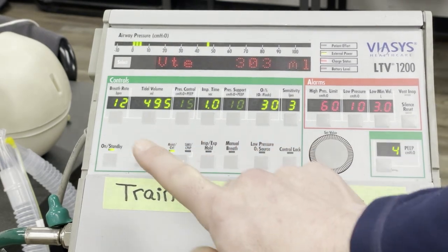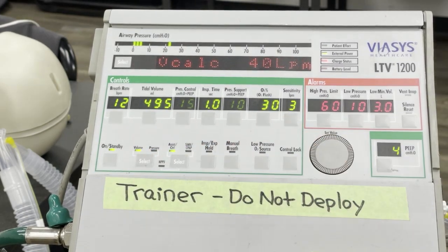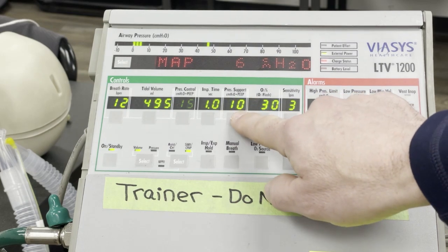Note that a pediatric patient or infant will receive ventilation by pressure control, not by tidal volume. If the ventilator mode is SIMV, the patient will have a pressure support setting as well.